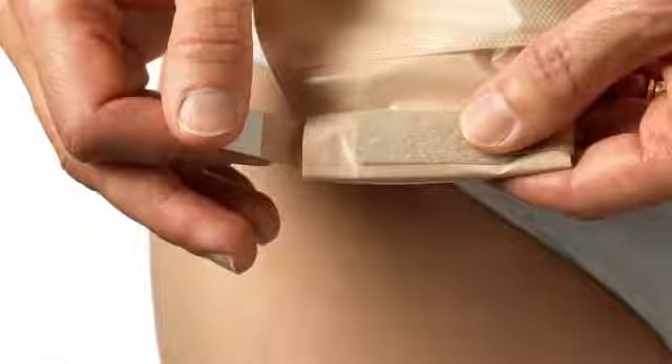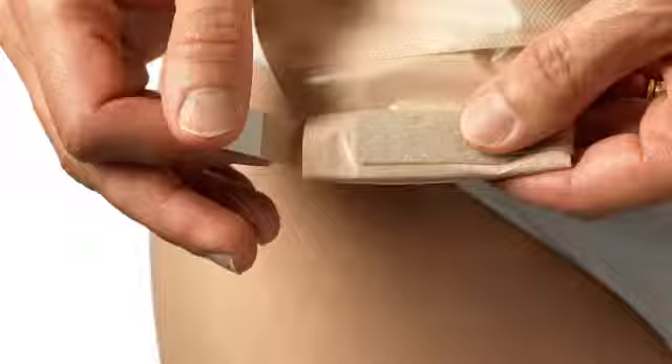Let's have a look at how to empty your ileostomy bag in an appropriate way. Decide for yourself which position is the most convenient for you. You'll need some toilet paper for cleaning the outlet.